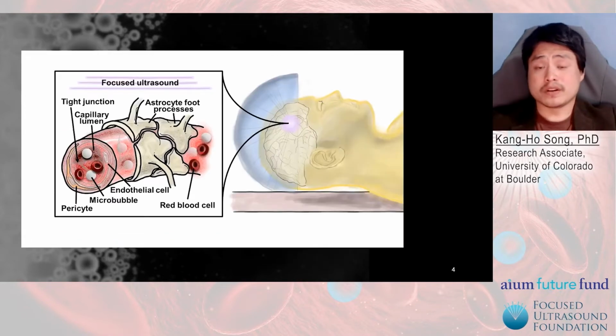In practice, microbubbles are generally injected, and if they are injected into the bloodstream, they will circulate through the entire body. In blood-brain barrier disruption, microbubbles that are flowing through the brain will be targeted with ultrasound and used to transiently permeabilize the brain vasculature to enable drug delivery.